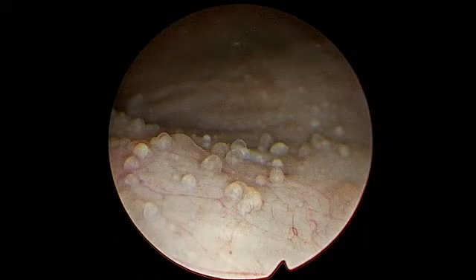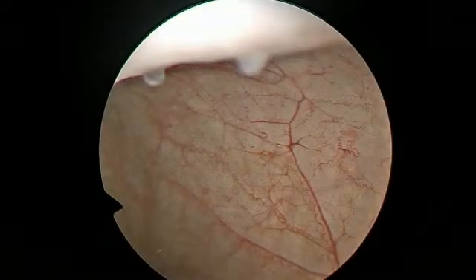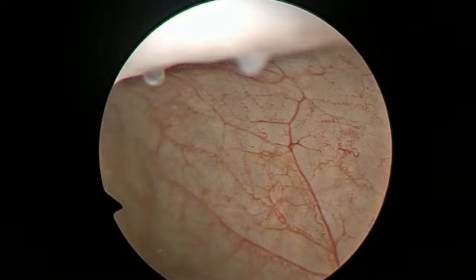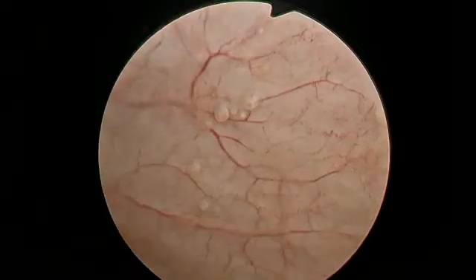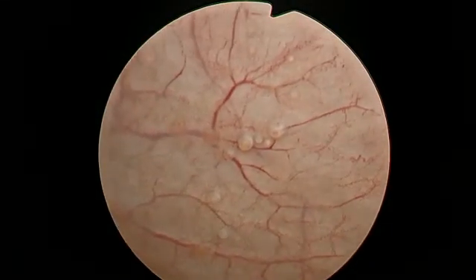These vesicles seem to ascend from the bladder base to the anterior bladder wall, oftentimes sparing the posterior bladder wall and dome.